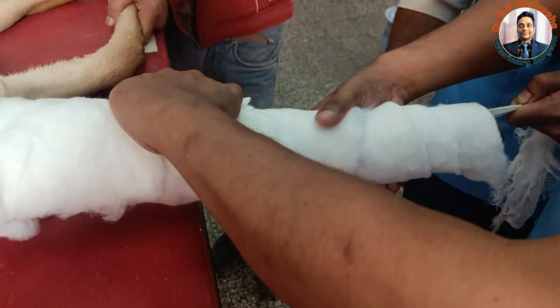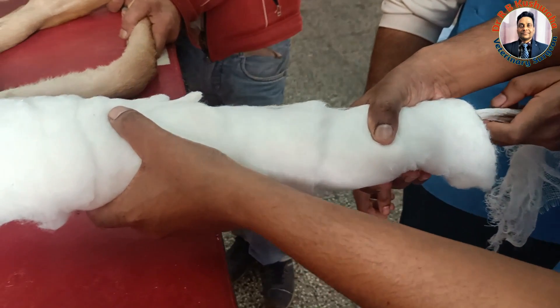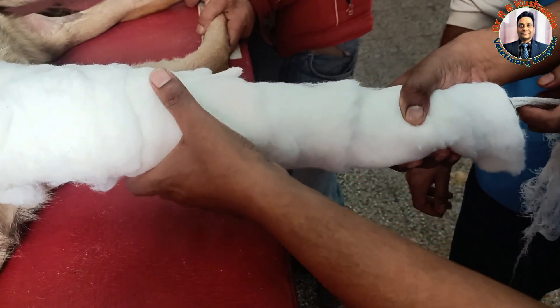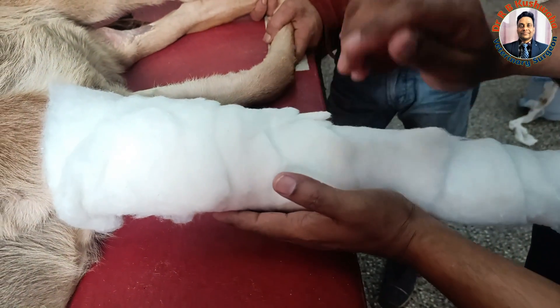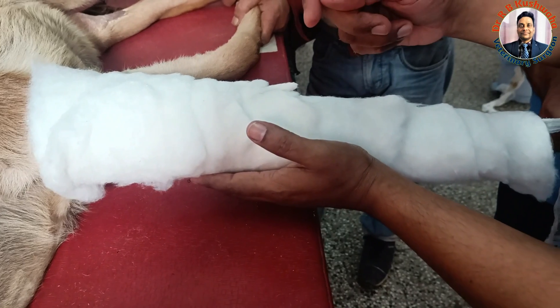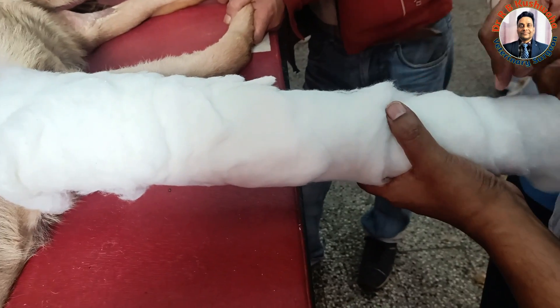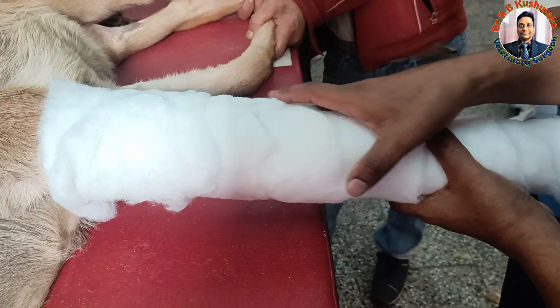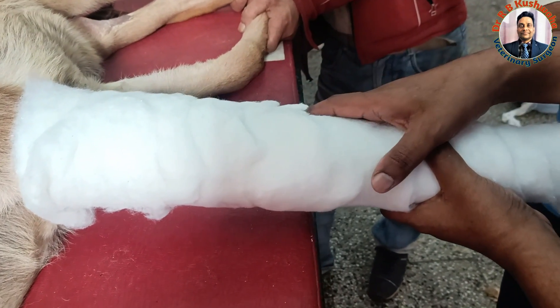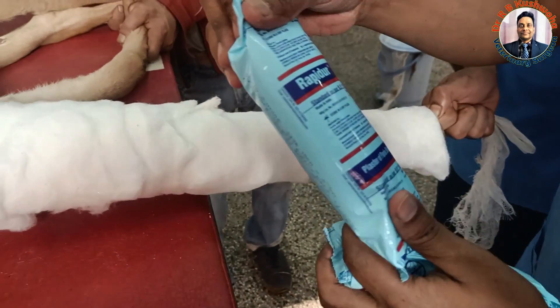After applying the cotton layer, some doctors go directly for splint application, then apply the plaster of Paris bandage over it. However, I prefer to first apply the plaster of Paris bandage and then fix both splints in between the layers of the plaster of Paris. This is the plaster of Paris bandage — the rapid-setting type.